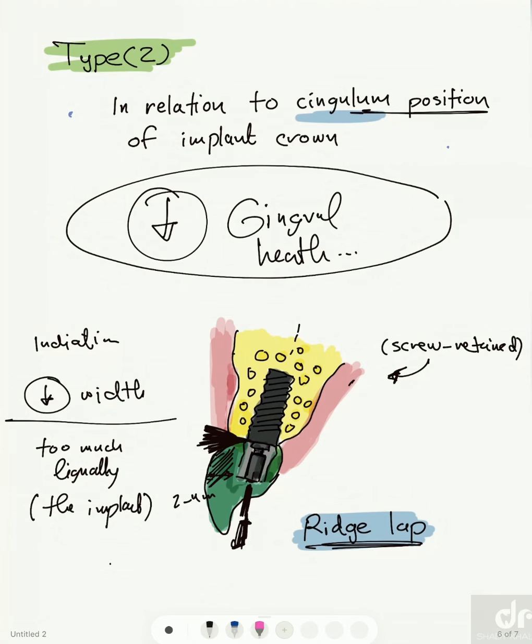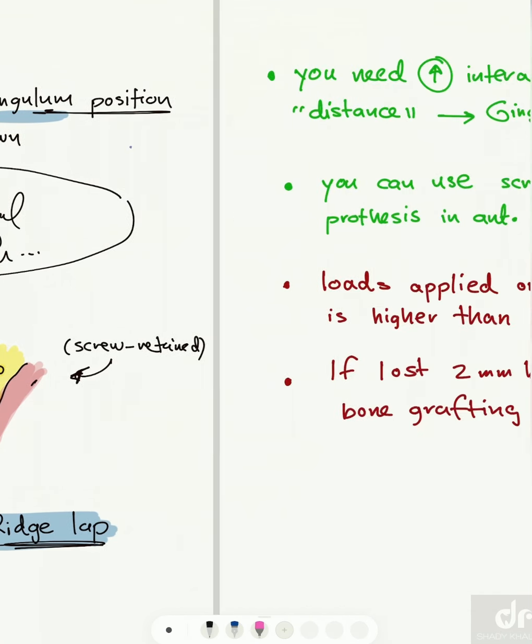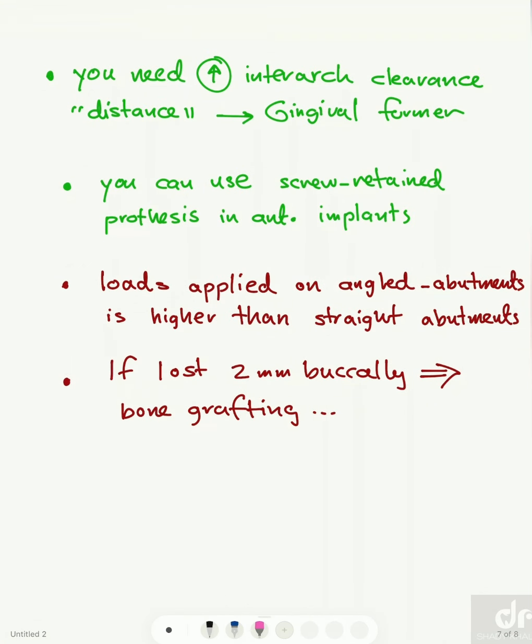Yes, but it will be very difficult for cleaning, so it will compromise the periodontal health and the gingival health of the site.